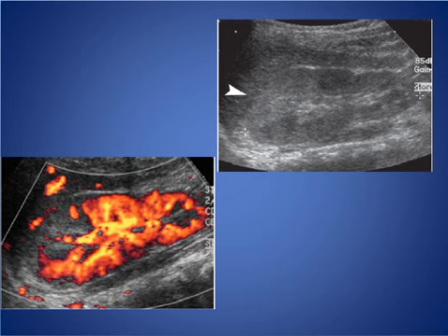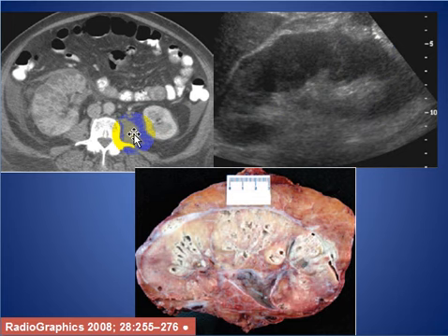The kidney is enlarged, otherwise normal, and the CT scan of this patient shows a global decrease of contrast material in the kidney with small attenuating foci due to abscess pockets, and this is the nephrectomy of this patient. And we see the small abscesses in the kidney corresponding to the CT scan.